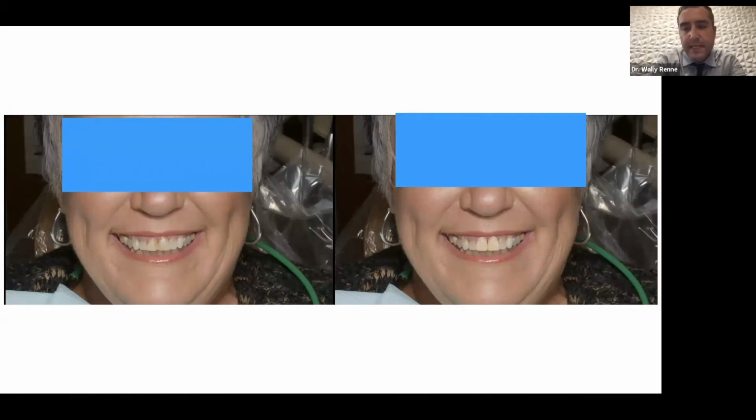The first stage that you really utilize the software in is patient communication. In this instance, this lady presented to me in my practice, and she said, I want 2 veneers on my 2 front teeth because I hate my front teeth. And I immediately look at her smile and know that 2 veneers is not going to help her smile. But how do you present that to a patient without either trying to sound like you're trying to sell them a lot of veneers, or sound mean, like, hey, 2 veneers is not going to help you, you need tons of work? That's really mean sounding.